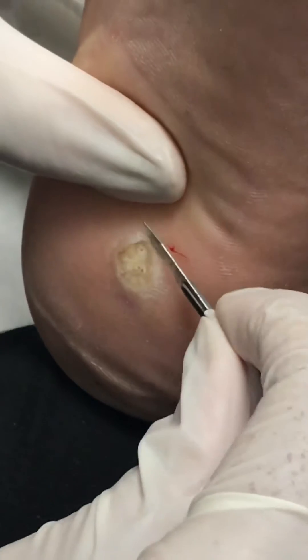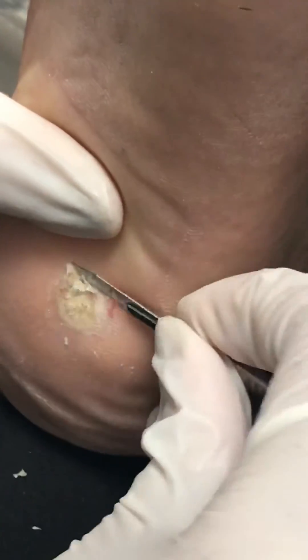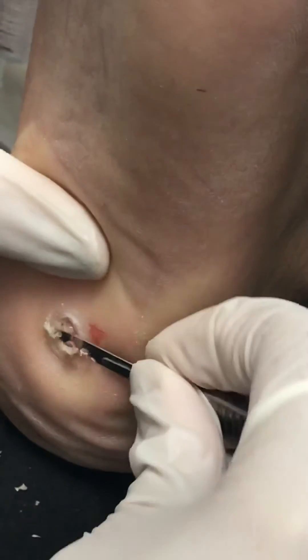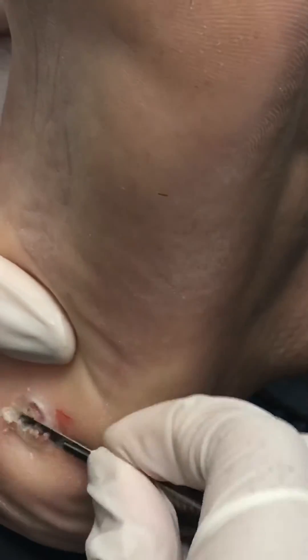Today we're just going to shave it down and then I'm going to put some acid on it. He's been treating it at home with acid, but we're going to see how far and how deep we can get. The way a wart grows is it grows up in layers, so the more you cut out, the more the wart grows out, and eventually it all grows out.